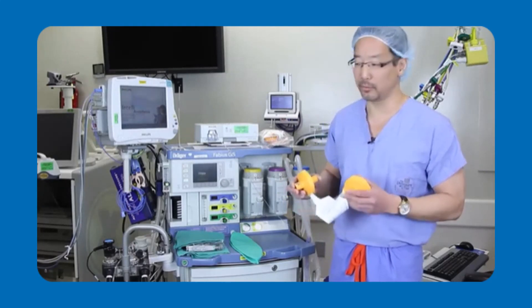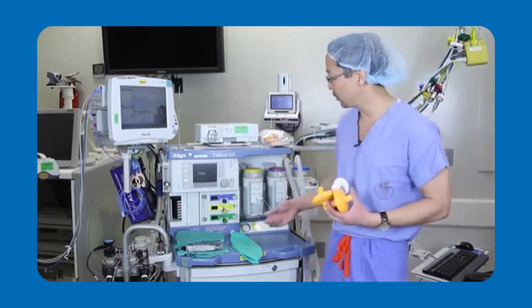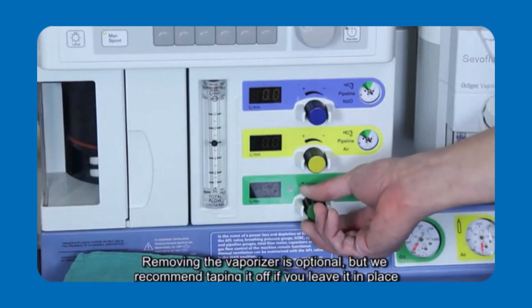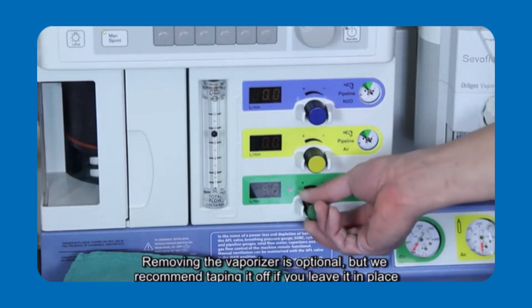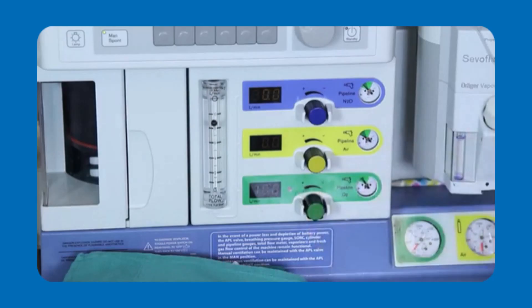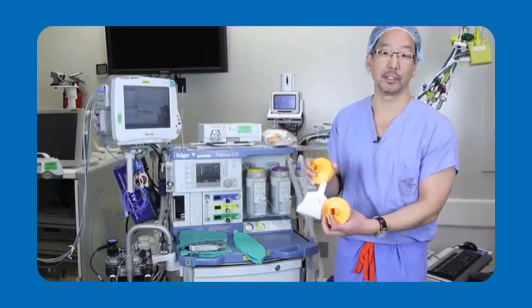The way I'll show you how to do that: first, we recommend turning your fresh gas flows up to 10 liters per minute or higher for 90 seconds. After those 90 seconds, we recommend placing these filters into the breathing circuit.